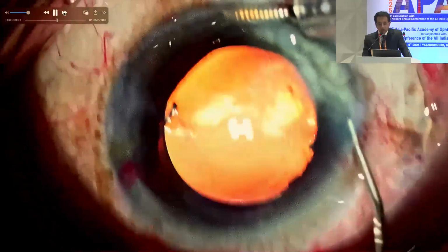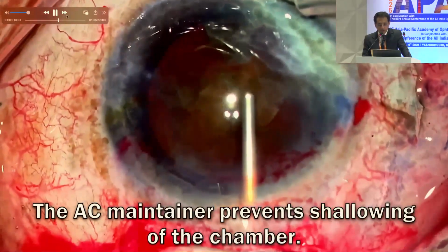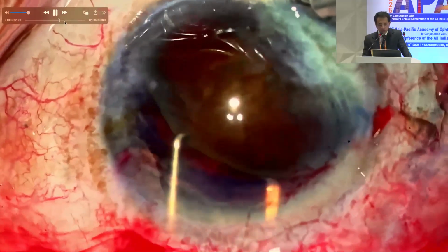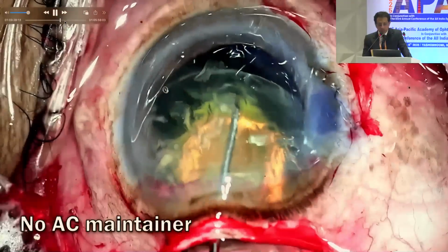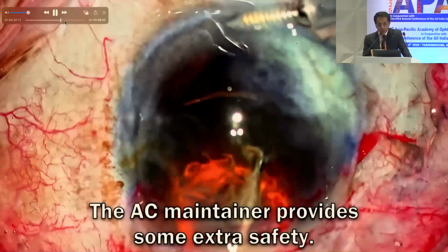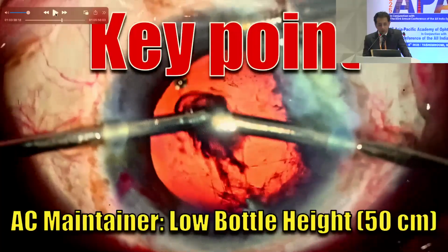Maybe there are many pioneers here who have used the AC maintainer in a better way and for longer than me, but I find this helpful, which is what I have been doing for the last year or so. During this step it is off, and this is done under dispersive OVD only during extraction of the nucleus. If there is no AC maintainer, the chamber is going to collapse at this stage, but you're going to keep the AC maintainer on, and this would prevent the collapse of the anterior chamber.